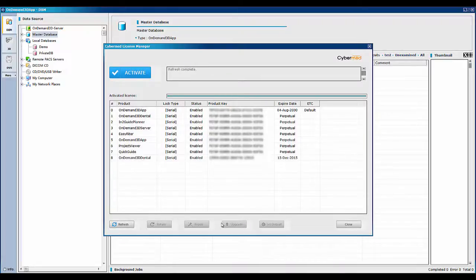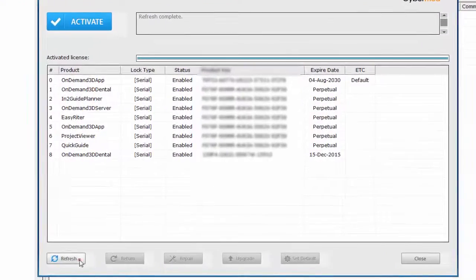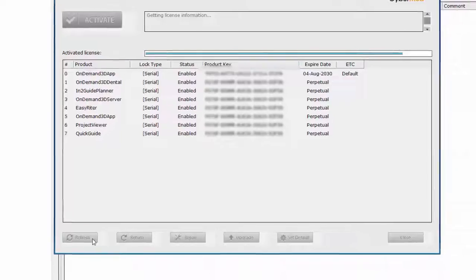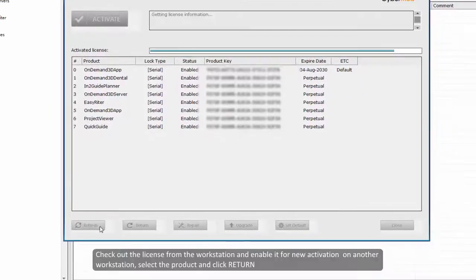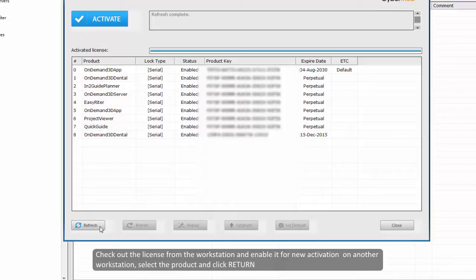If a license is missing, try to refresh by clicking the refresh button. If you would like to check out the license from the workstation and enable it for new activation on another workstation, select the product and click return.